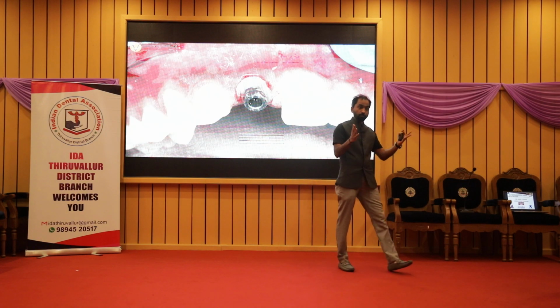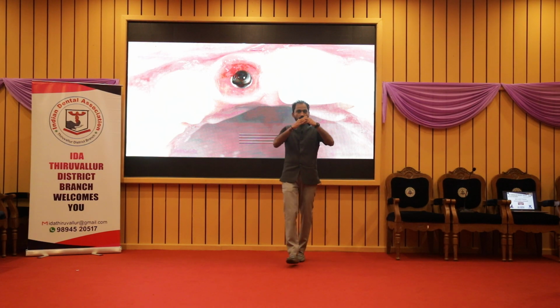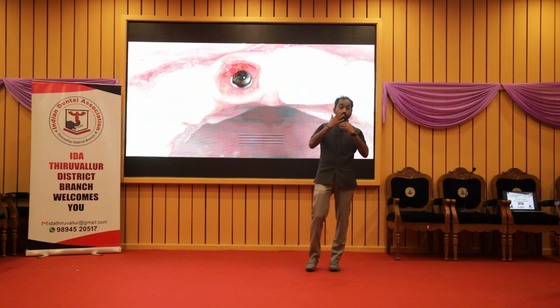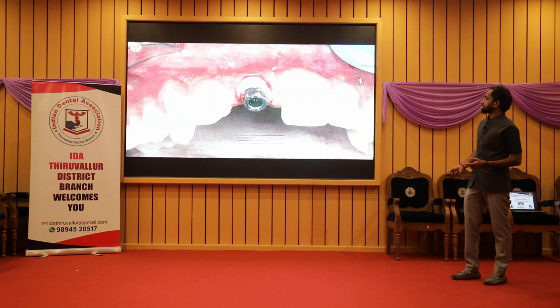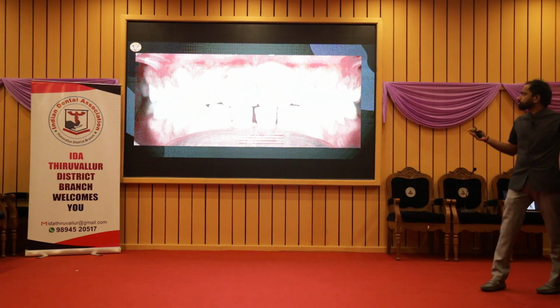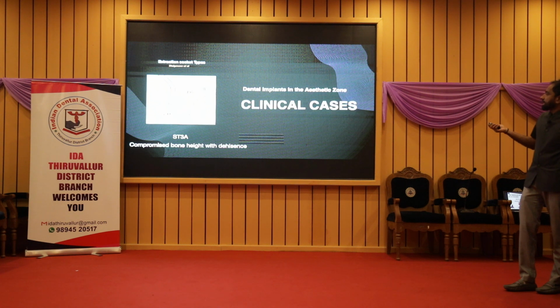It has to be highly polished, because these can have desmosomal or hemidesmosomal attachments to the zirconia or the ceramic. Whatever is going inside the gingiva should be highly polished. So this is a customized impression, and that is the crown which you receive. So pretty good. Otherwise everything went on fine, and this is how the patient is.